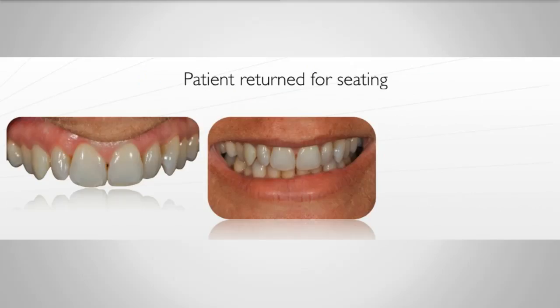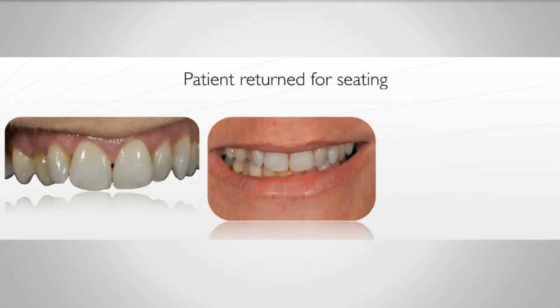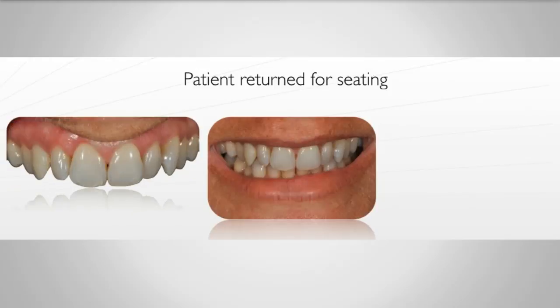Angela returned for seating of the crown. I'm going to show you the day of seating, because you remember the soft tissue form is already developed, so you simply seat or slip that definitive restoration into that previously developed sulcus, and you should not have any blanching or inflammation. All right, let me go back. This is the provisional restoration in place, but let's go back to the beginning.